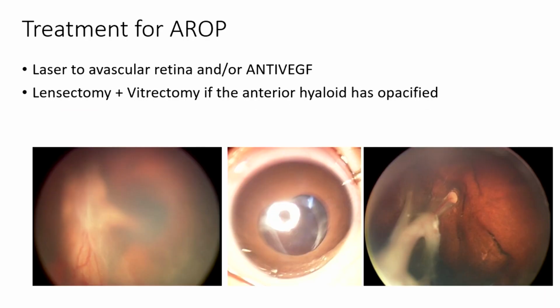And then the other eye had very bad disease, and it was almost touching the lens. The hyaloid fibrosis is already touching the lens, so we had to do a lensectomy vitrectomy. And you can see the end result. Those traction lines are there. All these are old traction lines. And look at the retina. This is the only viable retina, and that is inside the fold. Non-viable retina is all around. The child is going to have no vision. That's aggressive ROP. Thank you.